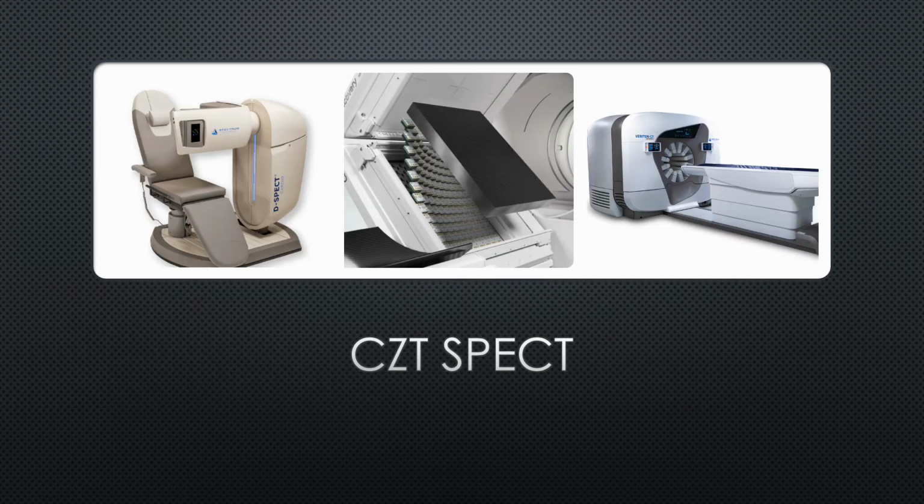And here we see three of these scanners. The cardiac specific DSPECT on the left here, so we can see the detector elements. They're quite relatively small detectors because they only need to focus on the heart. In the middle here we see the GE Discovery 870 CZT. You can see each of the detector modules sitting in a traditional detector design. It's the standard 50 by 40 centimeter design with a collimator sitting above that.